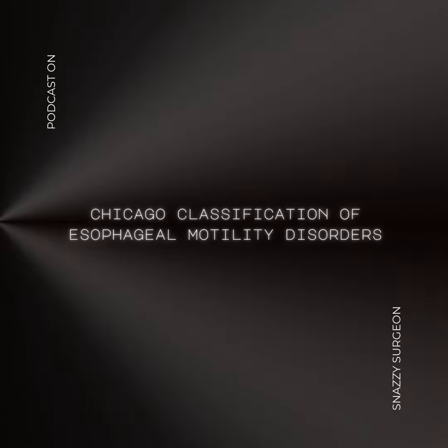Okay, let's move on to the other main category now, those disorders affecting the lower esophageal sphincter, or LES, and the EGJ outflow. The first one on the list, I think it used to be called hypertensive lower esophageal sphincter, is that right? You got it. But in the Chicago classification, we now call it EGJ outflow obstruction. And the key finding on HRM for this one is a median IRP that's consistently above 15 mmHg. That basically means the EGJ, that exit gate, isn't relaxing properly during swallowing. So the sphincter's not opening the way it should.